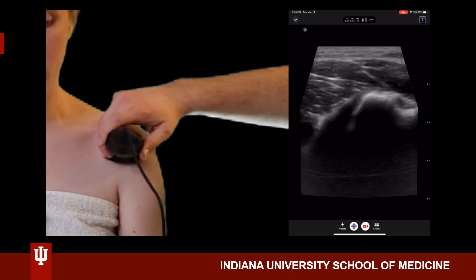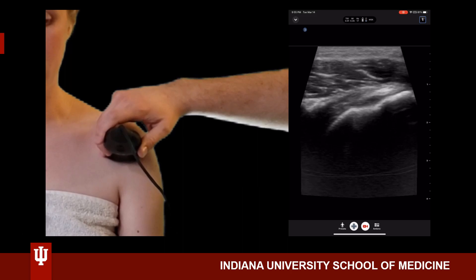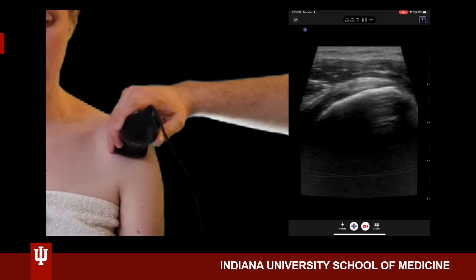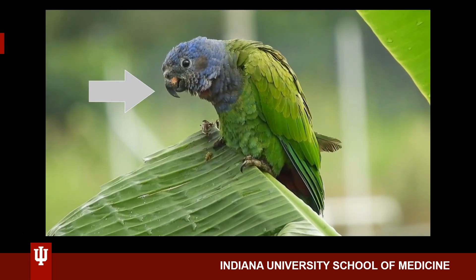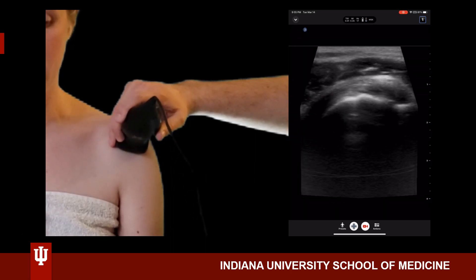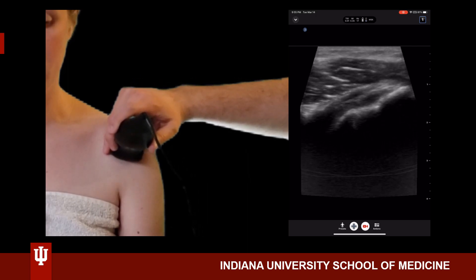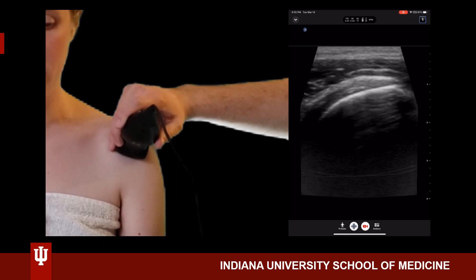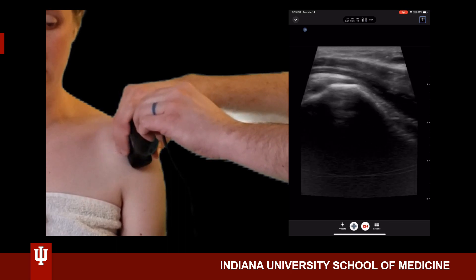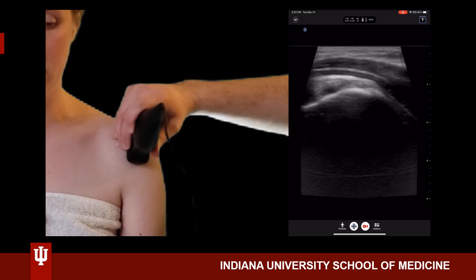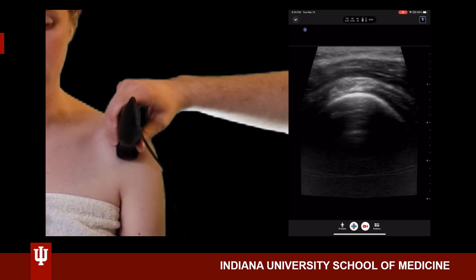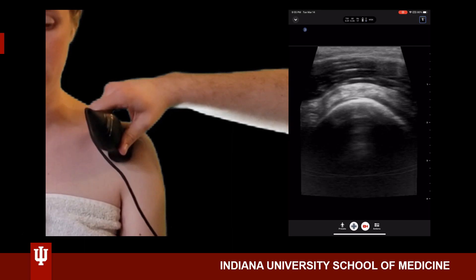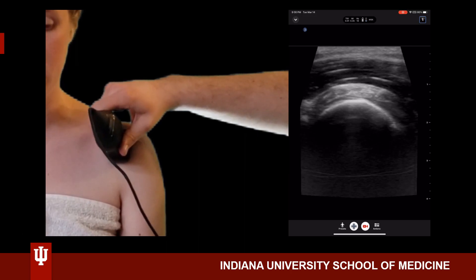Have your patient externally rotate their hand — that will bring the subscapularis tendon into view. The fibers will all be consistent and will have a bird's beak appearance. Evaluate this tendon all the way to the superior and inferior aspects, looking for any defects in the subscapularis tendon. Once evaluated in long axis, rotate your probe 90 degrees and evaluate the tendon in short axis, again looking for any large defects or tears. Make sure to continue wagging the probe because anisotropy can mistakenly look like a torn tendon.